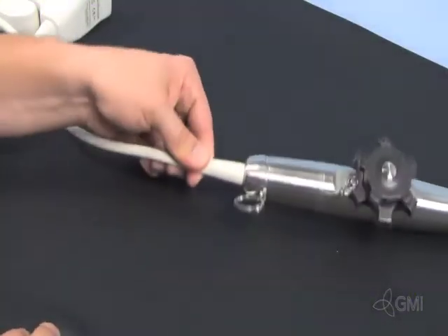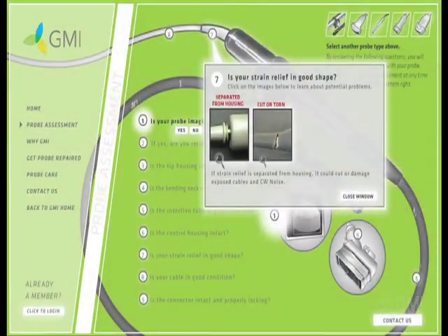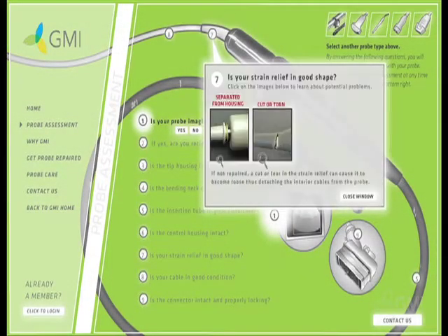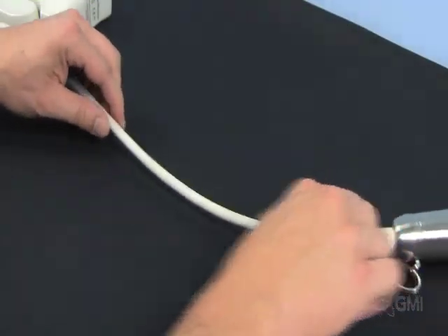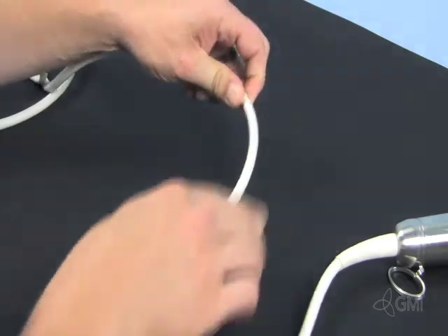Check the strain relief for separation, cuts, discoloration, and decay. Check the entire cable for stains, holes, cuts, and tears.